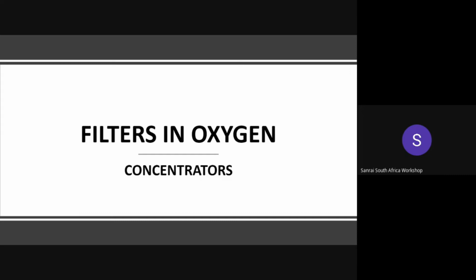Their purpose is to clean the ambient air that is drawn into the machine by catching the particles which I mentioned earlier, and prevent them from entering into the system. These filters differ in material and they also differ in quality, and that determines the size of the particles that can be captured. So now we will go through some of these filters, for both the stationary and the portable oxygen concentrators.